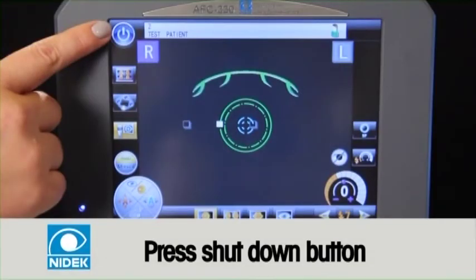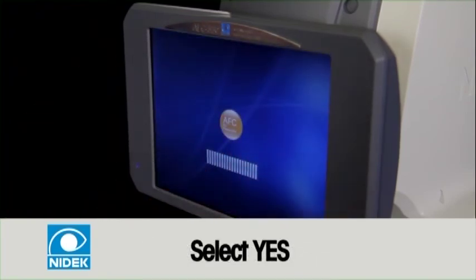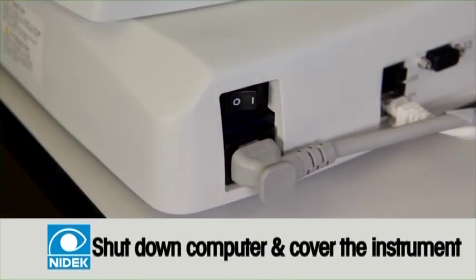The AFC-330 has an internal computer and must be shut down through the screen. Do not use the switch on the side until indicated by the screen. First, press the shutdown button. Then select yes when prompted. Turn the power off by the switch after the AFC signals you to do so. Lastly, shut down the computer.